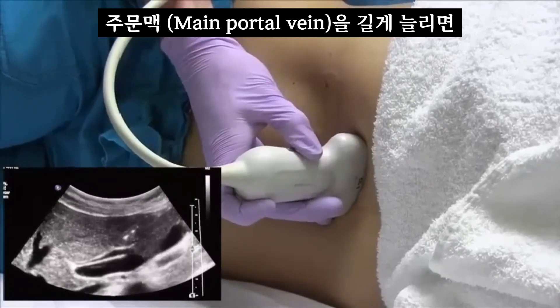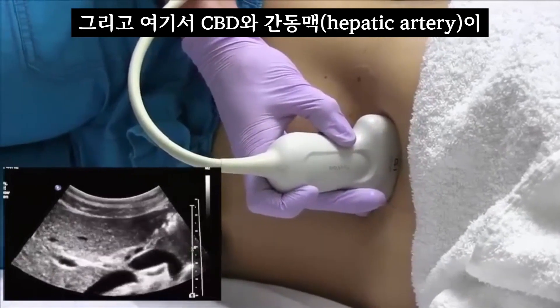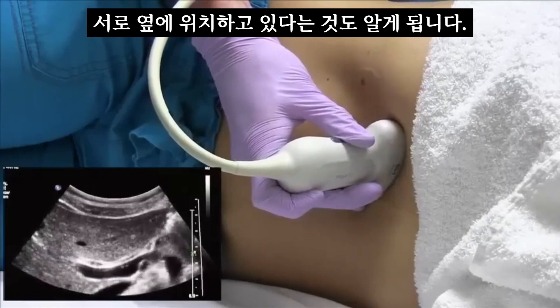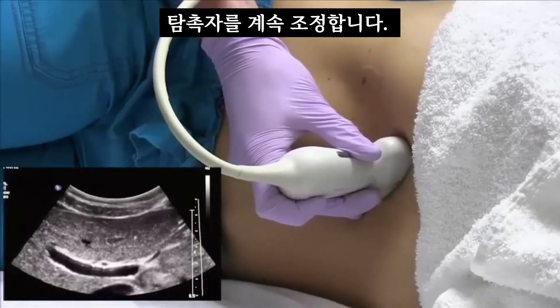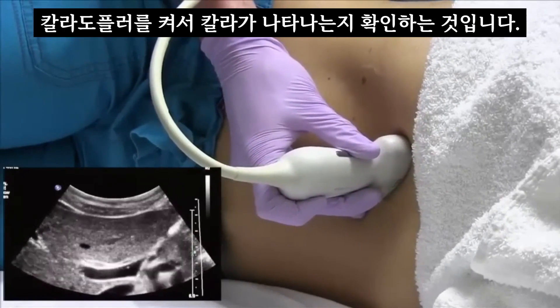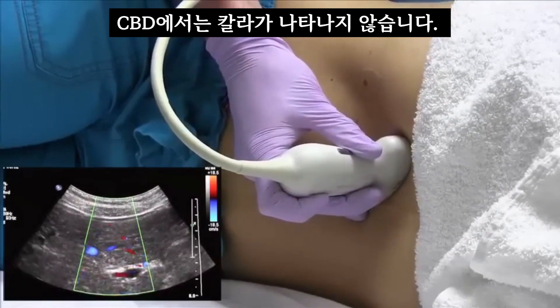For the porta hepatis, you want to elongate the main portal vein and you'll see it track right up into the liver. Once you find that, you know that the CBD and the hepatic artery are right next to each other. Keep tweaking the probe until you elongate one of these tubular structures next to the main portal vein. The easiest way to tell if you're on the hepatic artery or the CBD is to turn on color Doppler — if it lights up, you are on the hepatic artery; if it doesn't, that's the CBD.